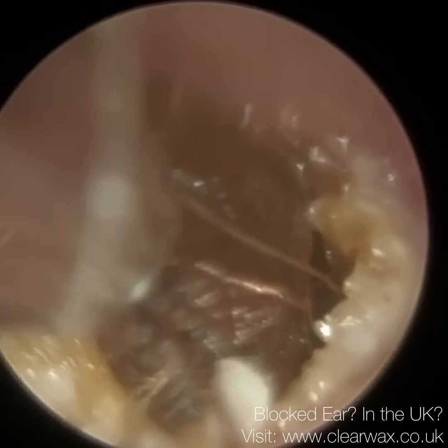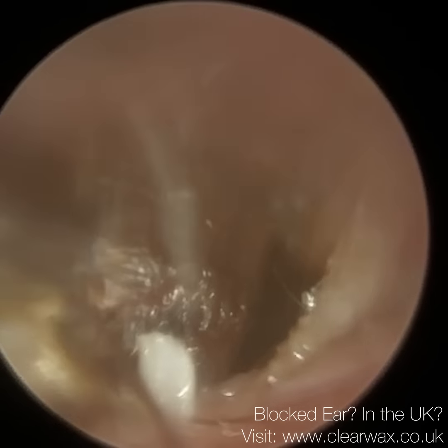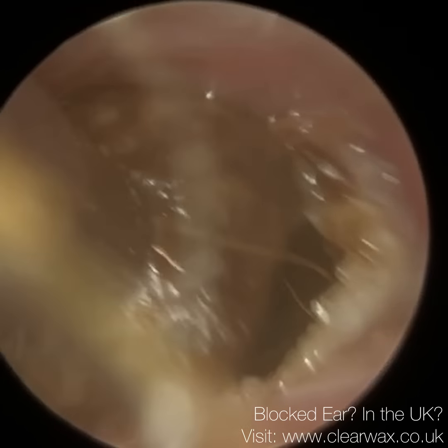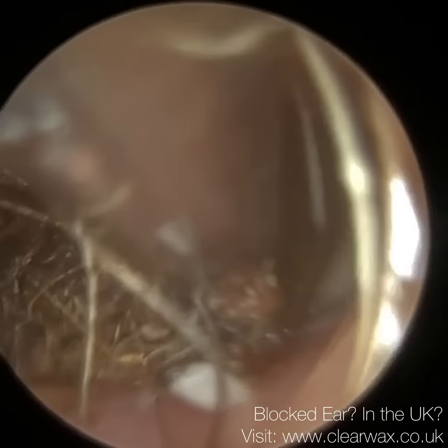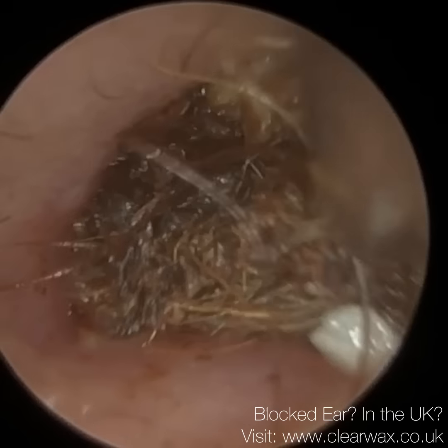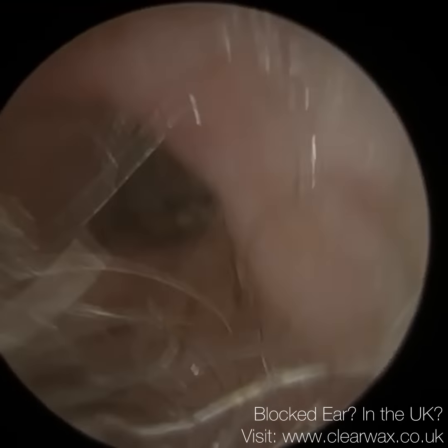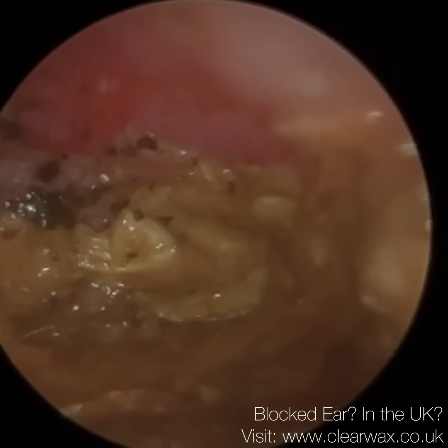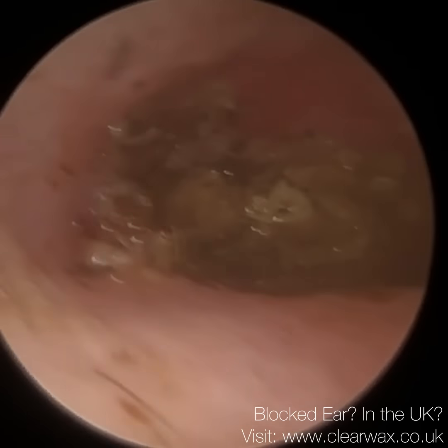Just giving it a little wriggle. It's just a hair at the entrance that's got slightly oily, so it's just blurring the view slightly. You can see those hairs there. And eureka. So now that I've removed this plug, it's going to make the rest of the procedure a lot easier. So there are some of the fungal spores. But I can't still fully see the eardrum now.